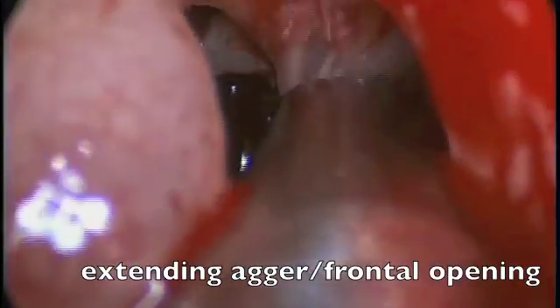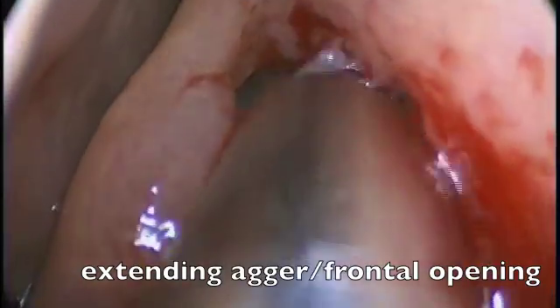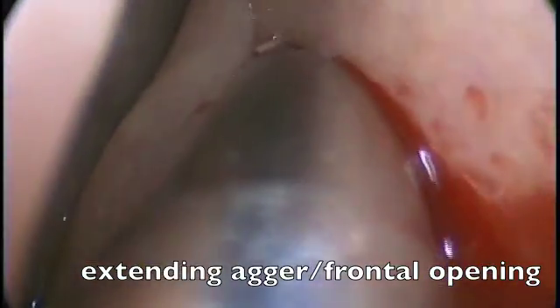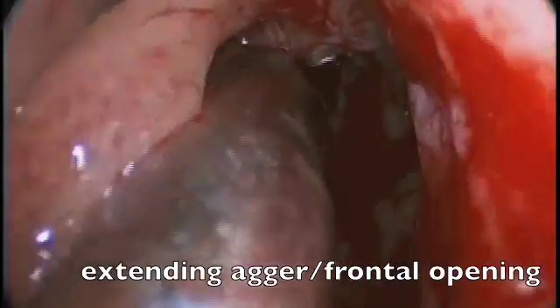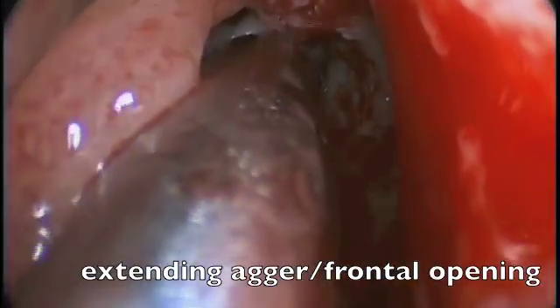Here we see the microdebrider in use, resecting tissue in the region of the agger nasi and the frontal outflow tract in order to maximize the flow from the frontal sinus.